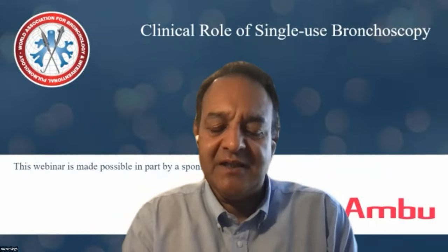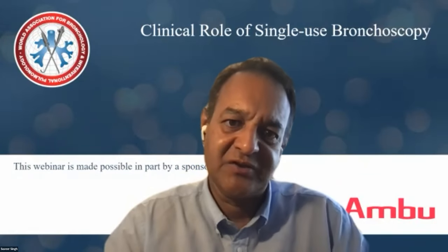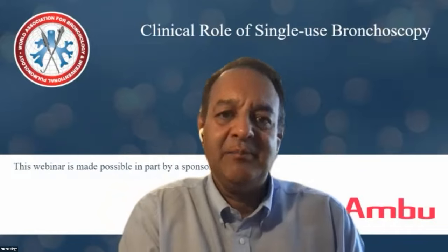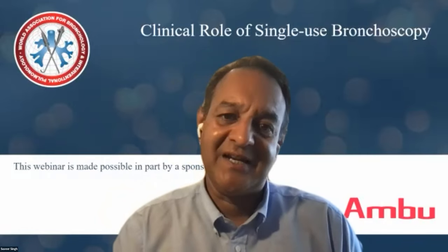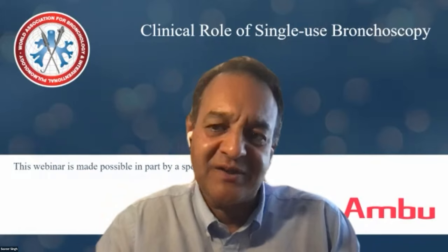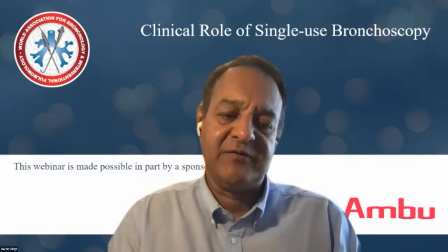And I think one of the rate limiters to good practice is that we don't necessarily perform best practice even with the single-use scopes. I've seen it in our own institutions that they're left out there for a few hours afterwards. No one flushes them through. No one wipes them down. No one necessarily leaves a must-be-thrown-away-by-this-time indicator. And I think that is a really important point. If it was me as a patient, I certainly wouldn't want that being reused on me a few hours later. Who knows what's in that working channel. So I think the correct answer is it needs to be thrown away. But the answer to your question is there isn't evidence to robustly suggest whether or not one can leave them out for a certain period of time after cleaning.